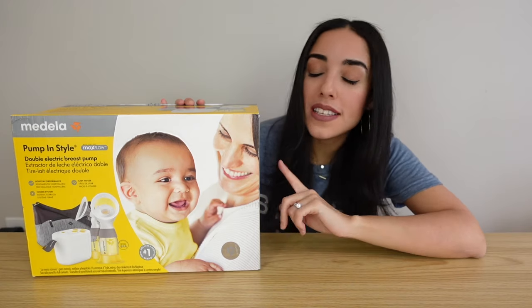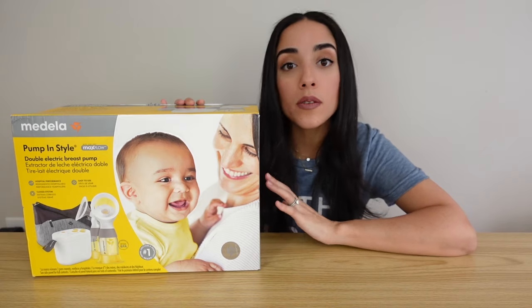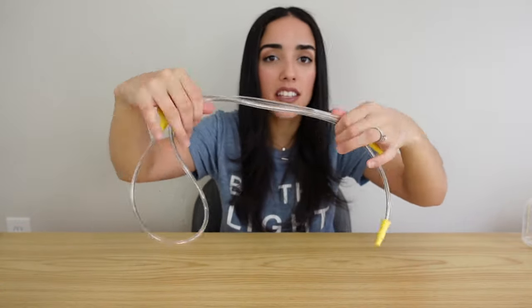When you receive your pump it's going to come in a box. Inside you're going to find your motor, and in a minute I'm going to be showing you guys exactly how to use it. You're also going to find the tubing that connects to your motor. Your pump also comes with a wall plug-in and a battery pack plug-in, which is really nice for if you're pumping in the car or on the go and you don't have an outlet.